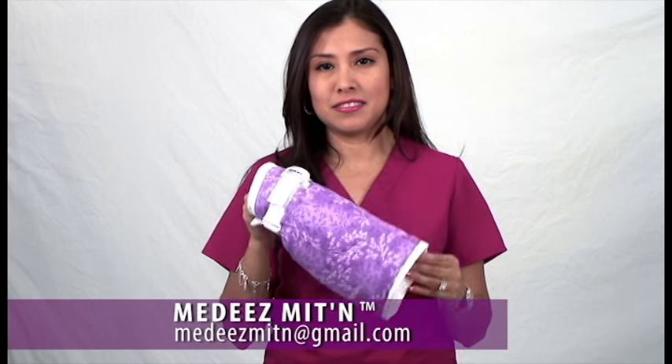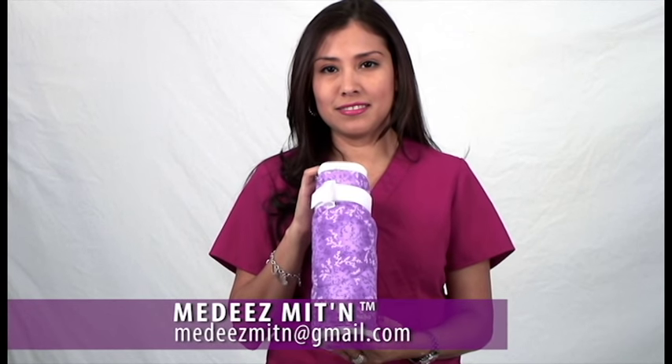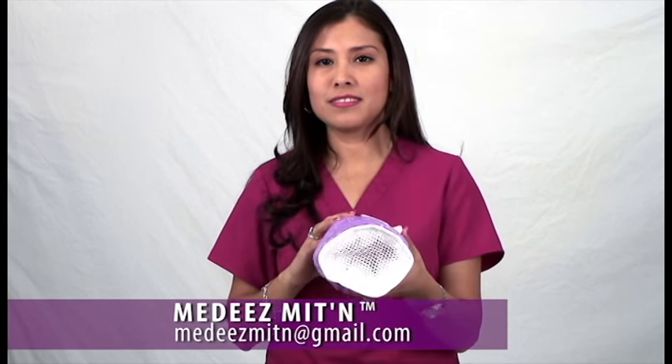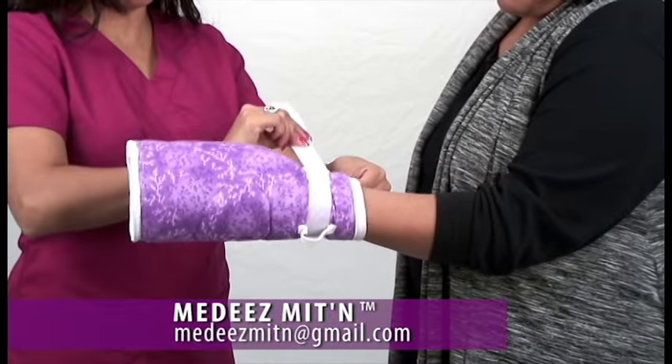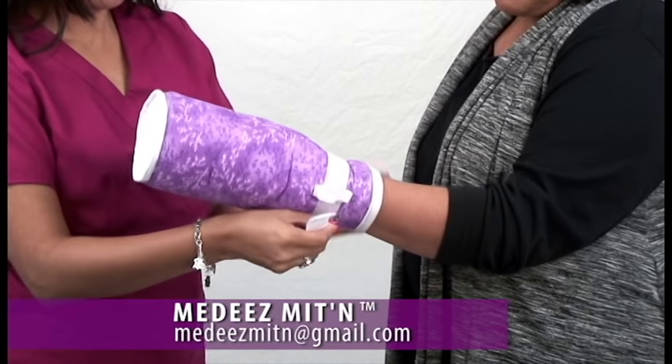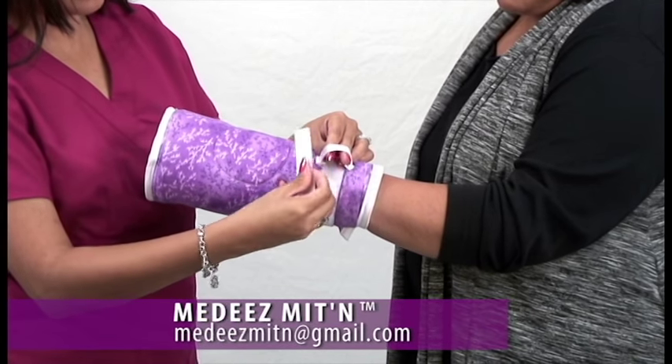Medis have unique and beneficial features that include a mesh for airflow and comfort while preventing fingers from being exposed. A hook and loop strap secures the mittens comfortably to the patient's wrists and prevents the patient from removing them.